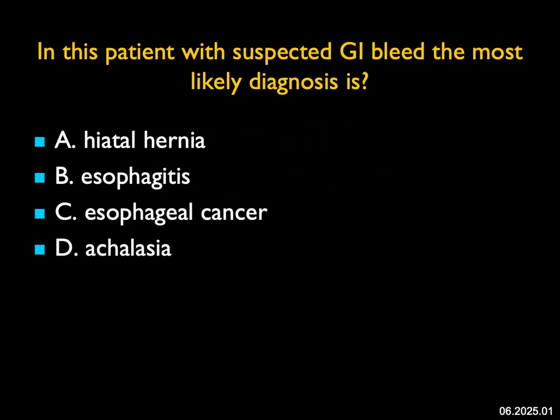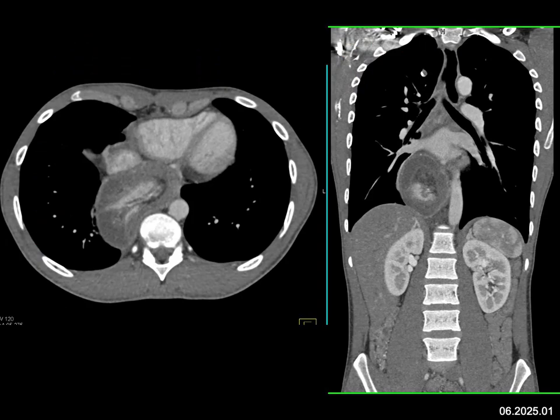In this patient with suspected GI bleed, the most likely diagnosis is — we're looking at something going on in the esophagus. The esophagus is markedly thickened all the way up and there's high density lower down. This is not simply a hiatal hernia, not just esophagitis — the wall is too thick. Cancer could be, but it's pretty smooth, though it's always a thought with the sharp margins and the transition by the GE junction. This is more like achalasia.